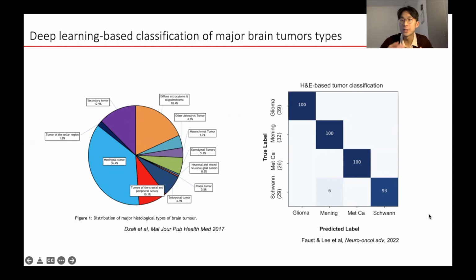And these were reasonable errors because the two whole slide images look very much like meningiomas, having spindle features and other properties that might be commonly mistaken for meningioma. So for a starting point, this was a very promising result. And also, these two could further be corrected if we were to use molecular markers, as I've suggested, such as SOX10 in this case.